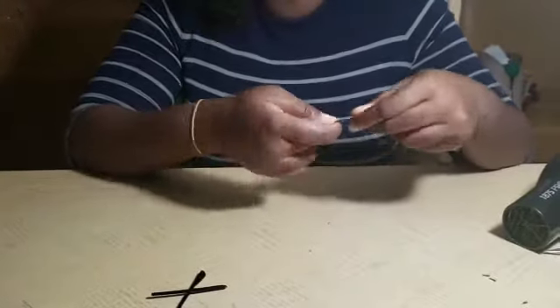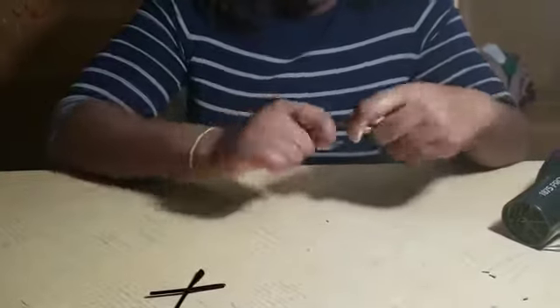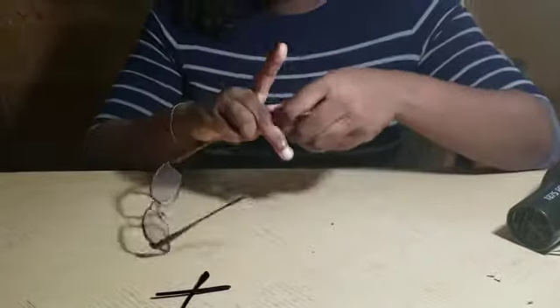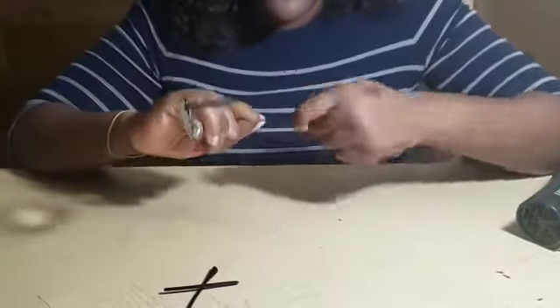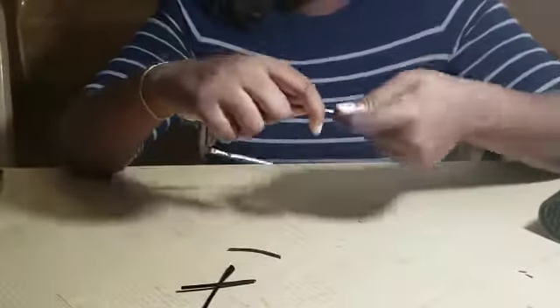Once you've made it straight, we're going to twist and pull the temple tips off. We do this by holding on to the frame and pulling it off. We're going to do the same thing to the other side — twist and pull.